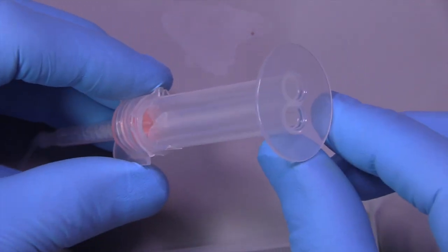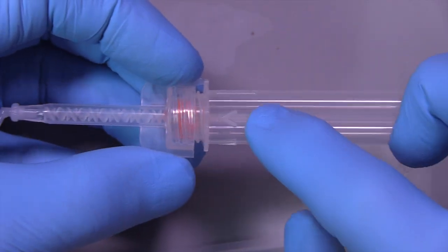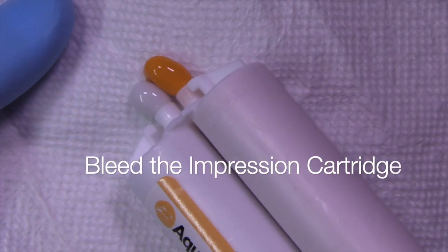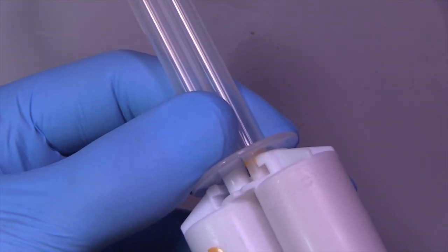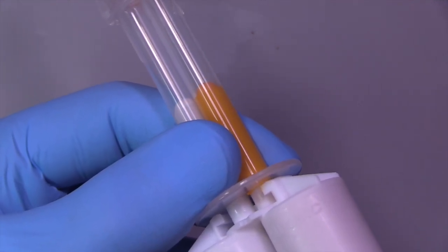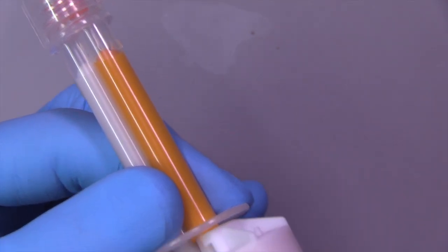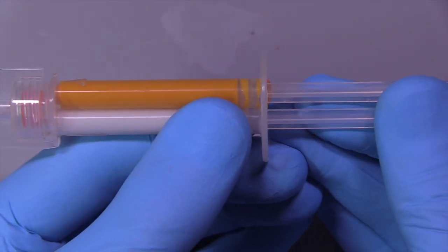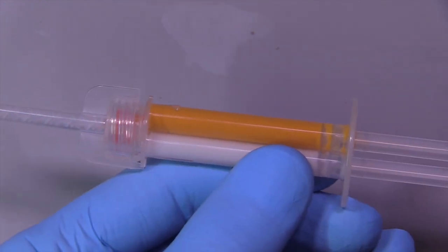The little tip rotates 360 degrees, it's very small, and it has a chamber that you fill up to a little V-shape with your light body material. When you're ready to activate it, you twist a little knob that releases the material from the double-barrel portion and allows it to go into the mixing chamber. Make sure to bleed the impression material — I'm using a light viscosity material, putting the syringe up against the end of the cartridge, pushing slowly and carefully to that V-shape, then breaking it away quickly. Then add the little plunger to the back end and push it in gently until the material goes to the top of the double barrels.